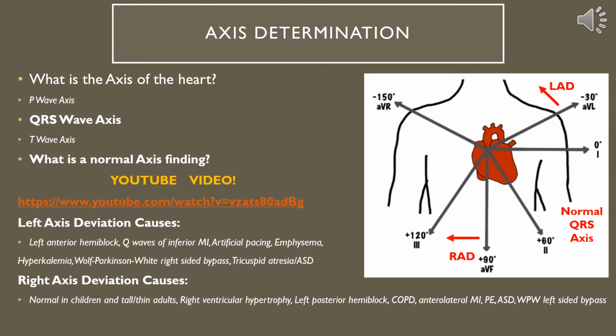I've included this YouTube video to watch, which I think is very helpful in breaking down axis deviation. So I would recommend taking a moment to pause and look at this YouTube video, because I think it helps really break it down simply as far as evaluating axis deviation.